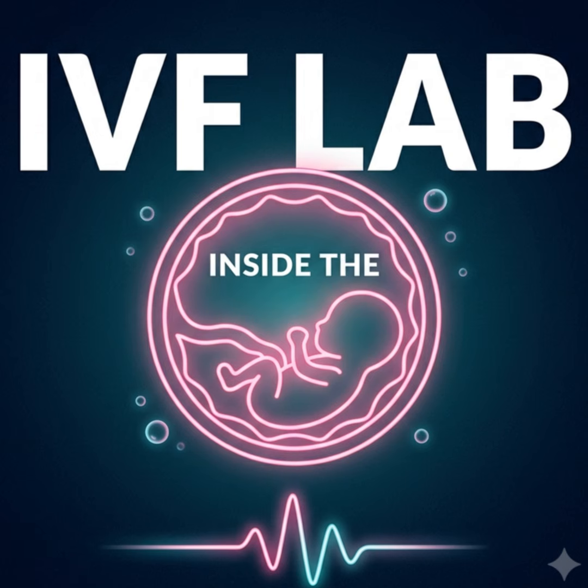Wow. The analogy that immediately comes to my mind is baking a highly delicate, incredibly finicky dessert like a souffle. Oh, that's a perfect analogy. The recipe explicitly warns you, do not open the oven door. Every time you open that door to check if the souffle is rising, you let the ambient heat out, you change the humidity, you cause a sudden draft, and you risk the entire cellular structure of the dessert just collapsing. Taking an embryo out of the incubator for a static check is exactly like opening the oven door.